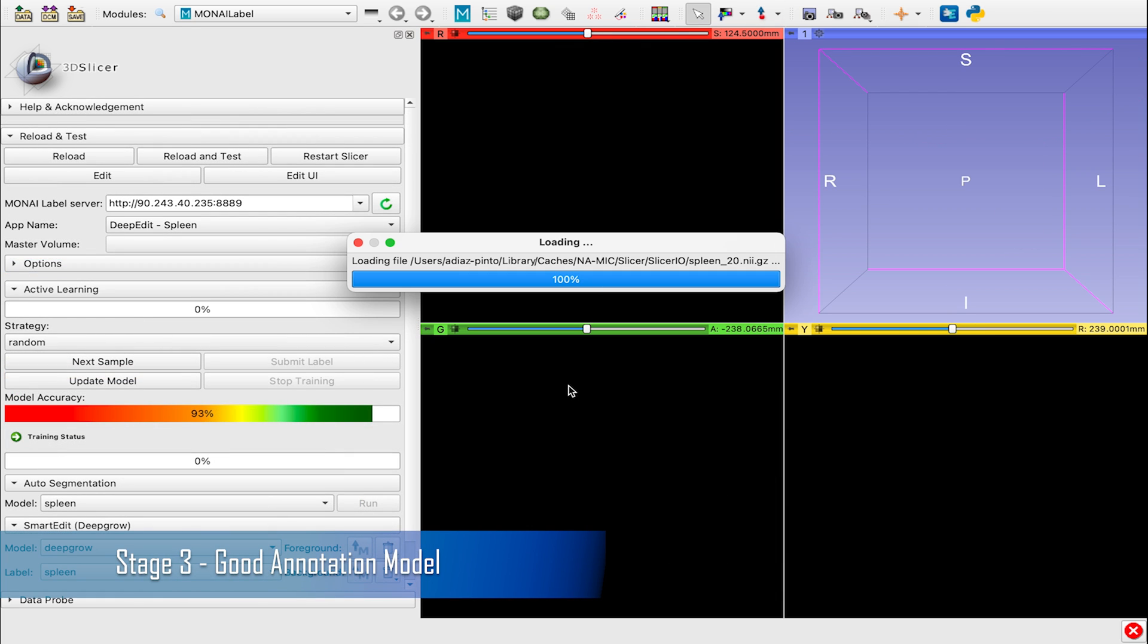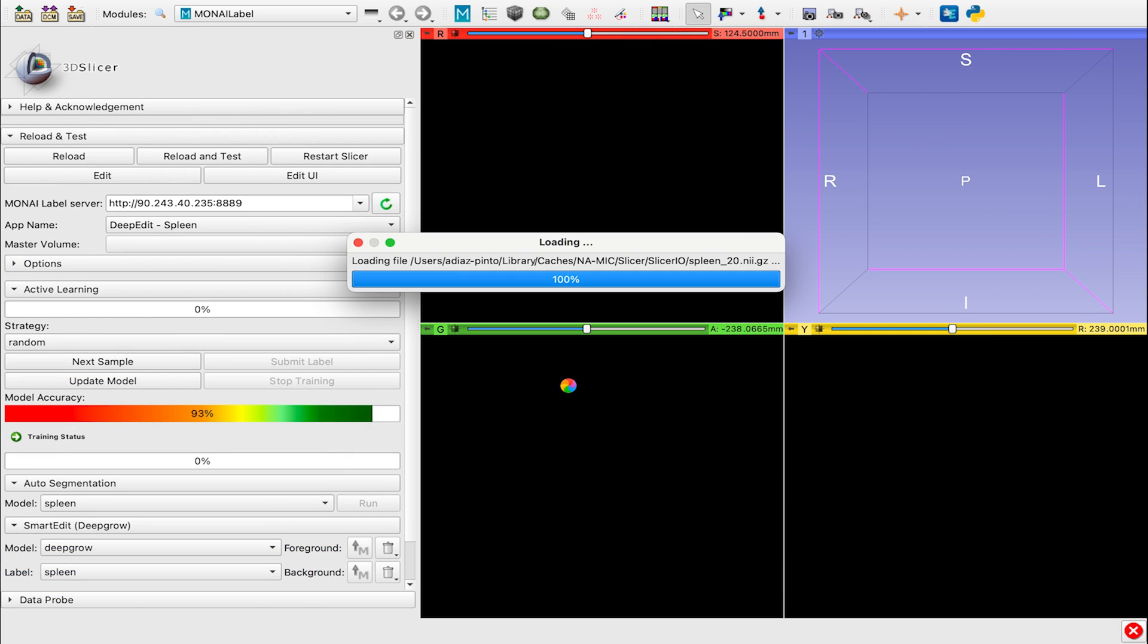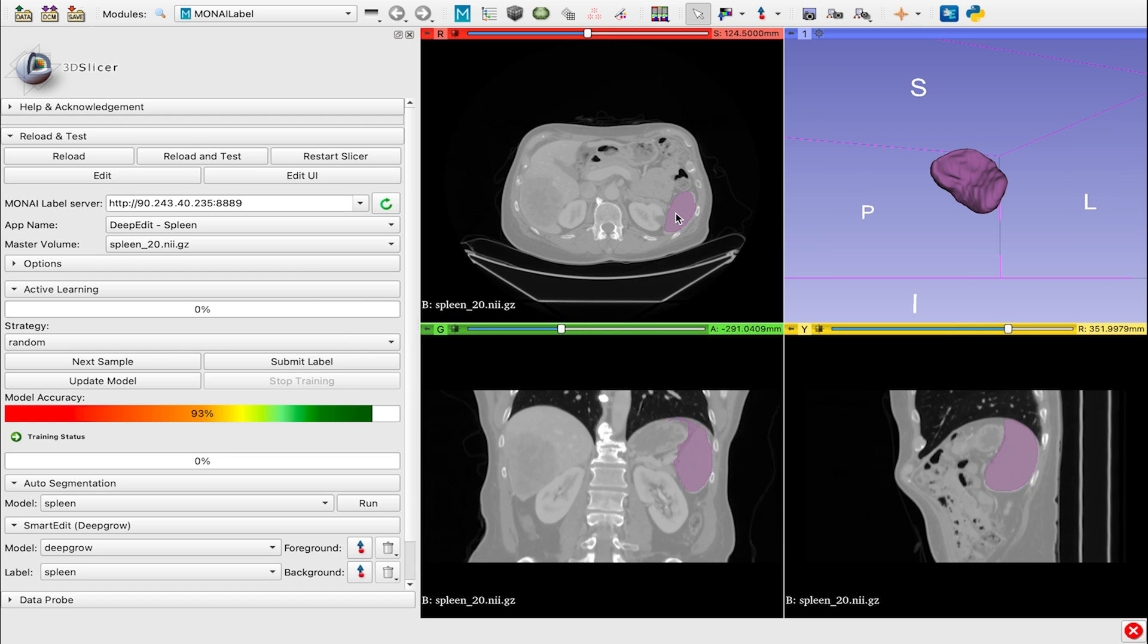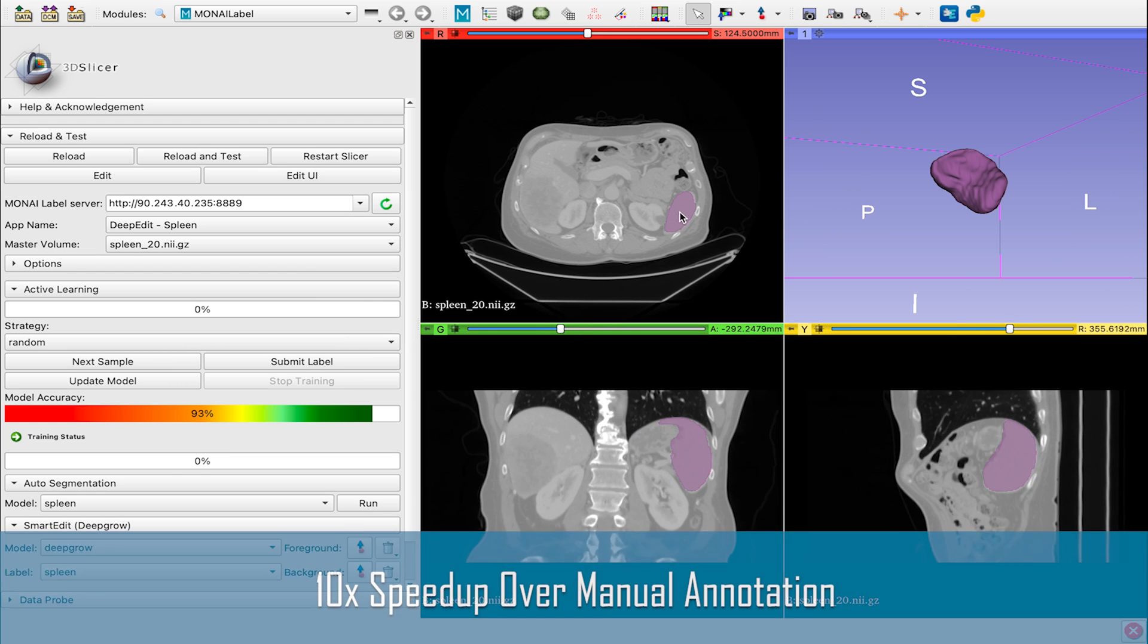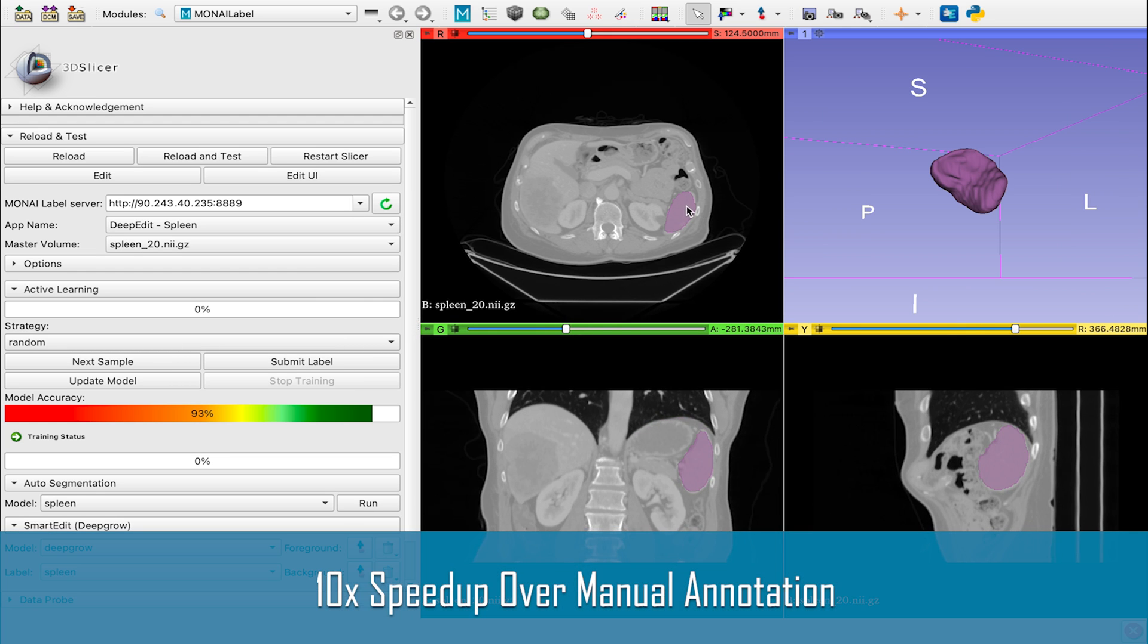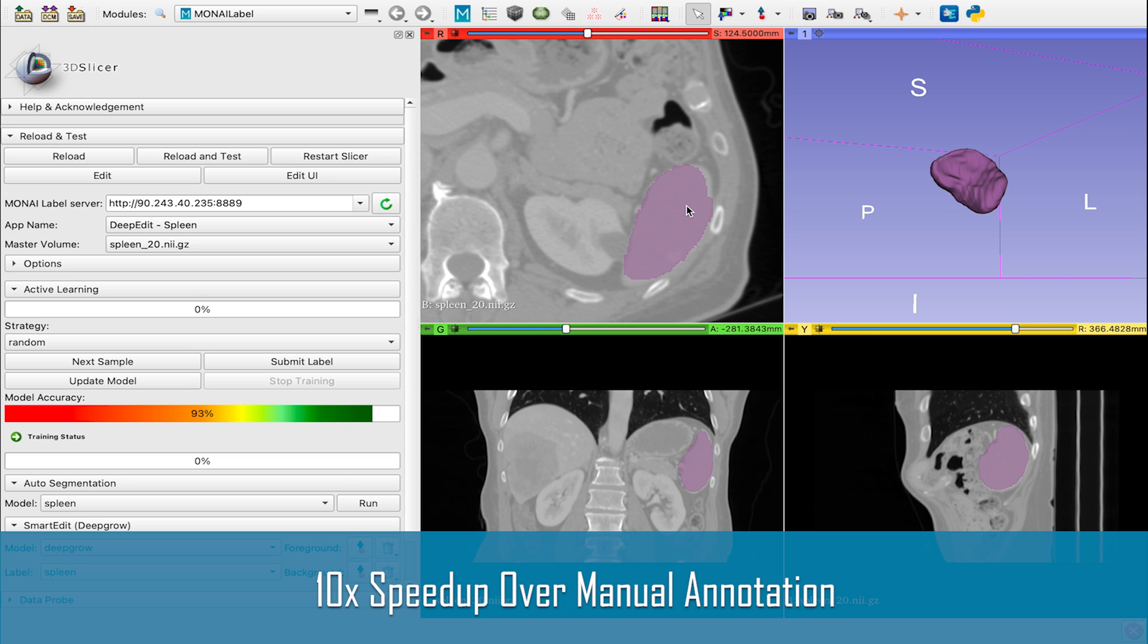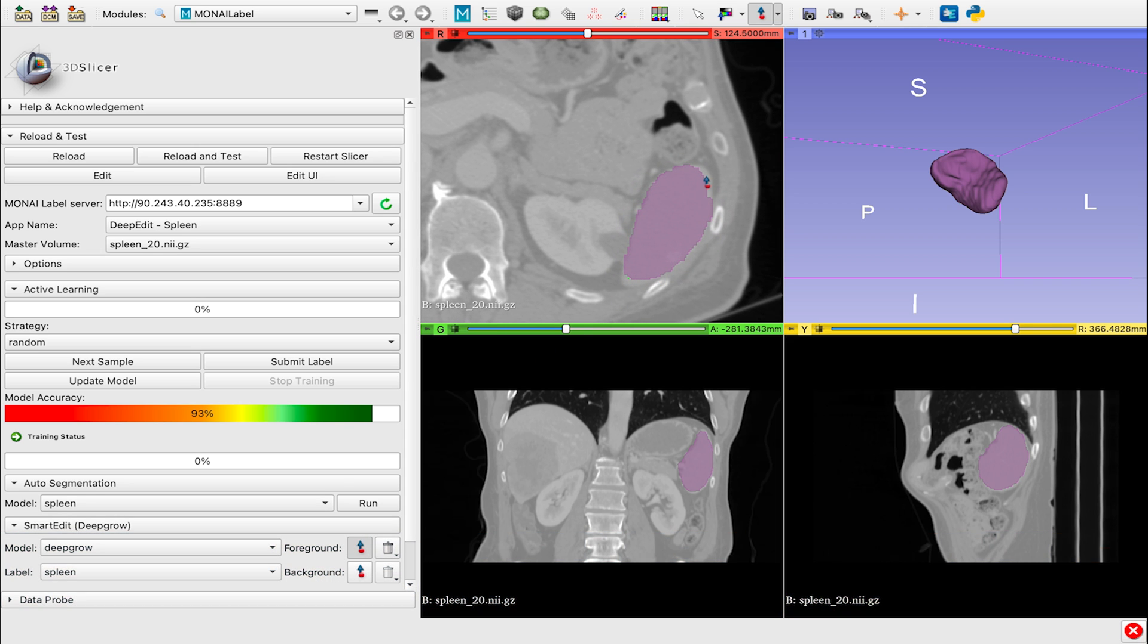Stage 3: Once we've sufficiently trained our model, our annotation is only taking about 1 minute per image. You can expect up to a 10x speedup over your initial manual annotation time. You now have an AI model with state-of-the-art performance ready to annotate on your given task.